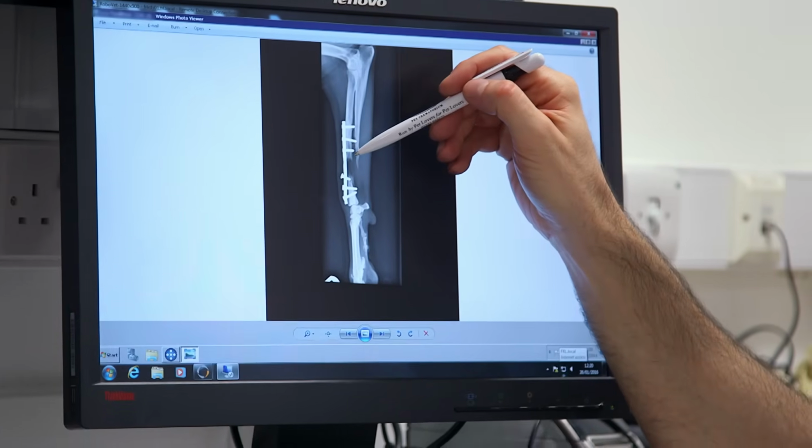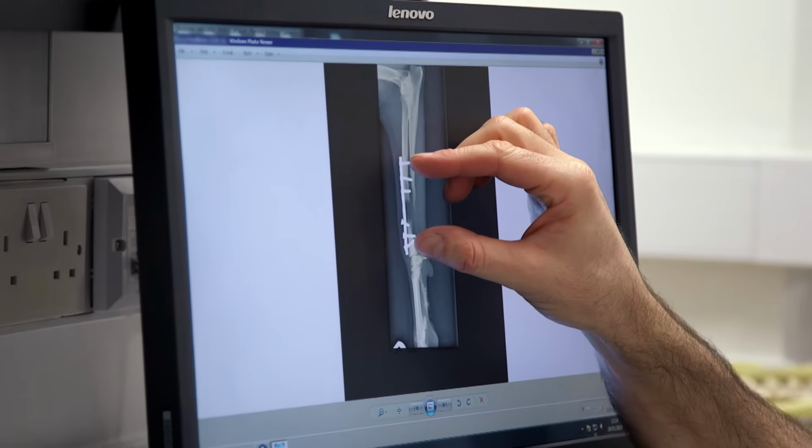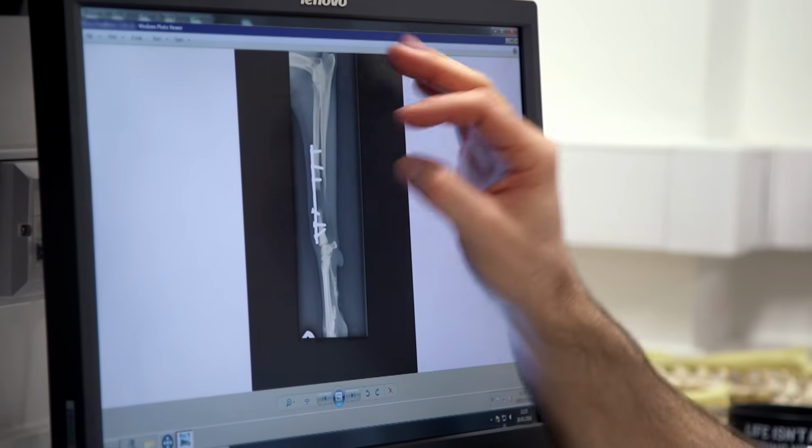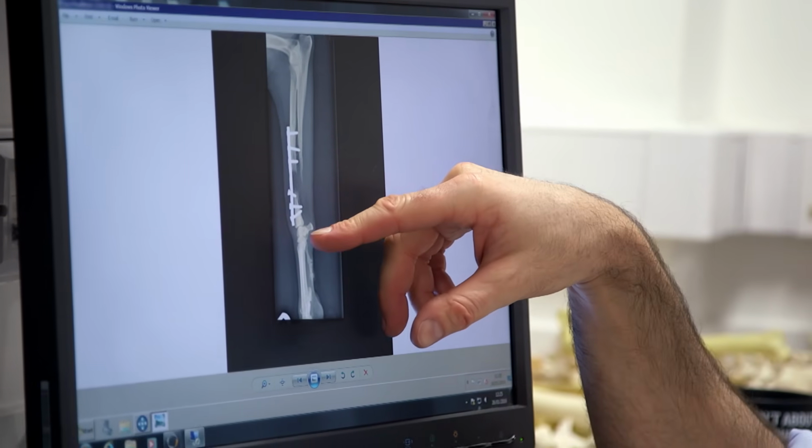The next option is something that is brand new, and we don't know for sure if it would work. You would chop out all the dead bone and the dead space, and you would fill that gap with a titanium scaffold containing stem cells. And those stem cells will be extracted from this dog's own bone marrow. The problem we've got is that there might not be enough bone to attach the scaffold to, and you might have to bridge right across the wrist. So effectively you'd be fusing the wrist solid.